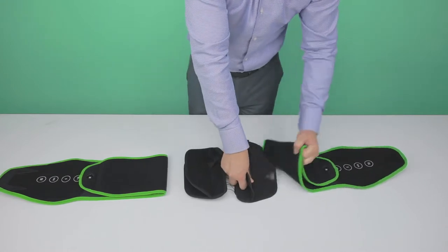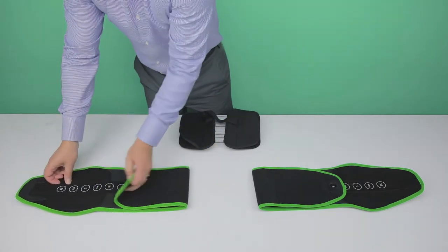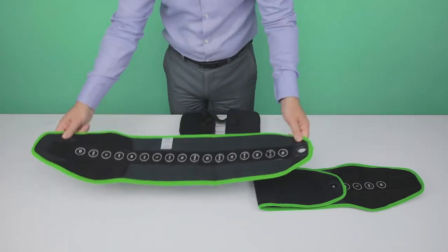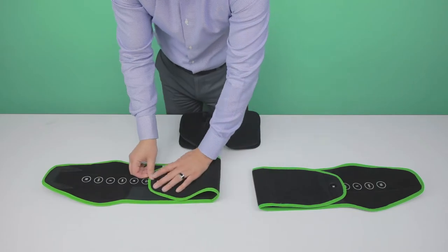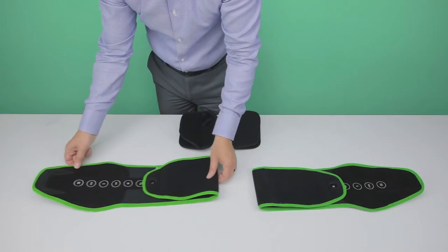Select the desired size from the available sizes, extra small to 5 extra large. Place the size indicator over the desired size. Both panels should be set to the same size. Fold the end of the brace and press down firmly.